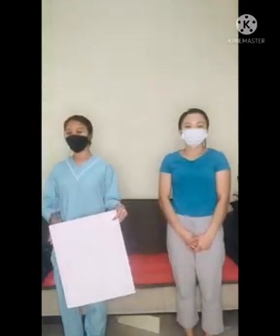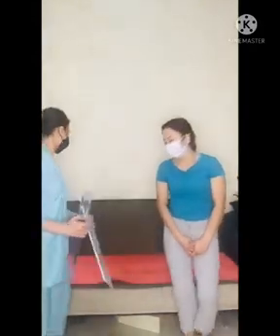The 10th projection that we're going to do is the AP axial pelvic inlet, for which we're going to use the 14 by 17 image receptor. So, the patient is in supine position. Our patient is in supine position. The lower limbs are internally rotated 15 to 25 degrees from the hip.